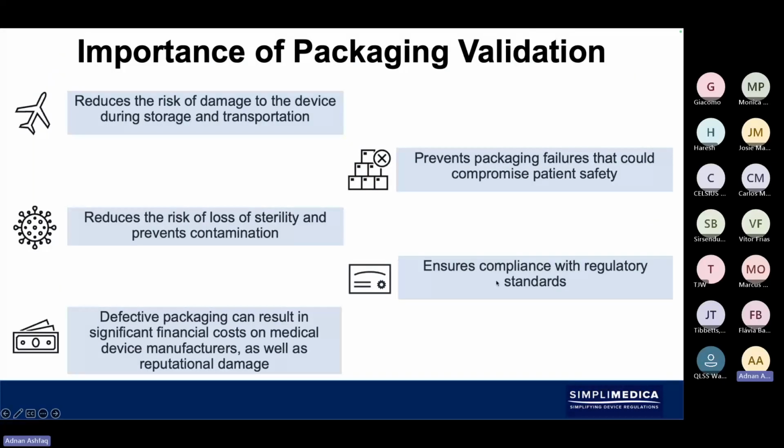So the importance of packaging validation can be to reduce the risk of damage to the device during transportation and storage. It's also to prevent packaging failures that could compromise patient safety, reduces the risk of loss of sterility and preventing contamination.